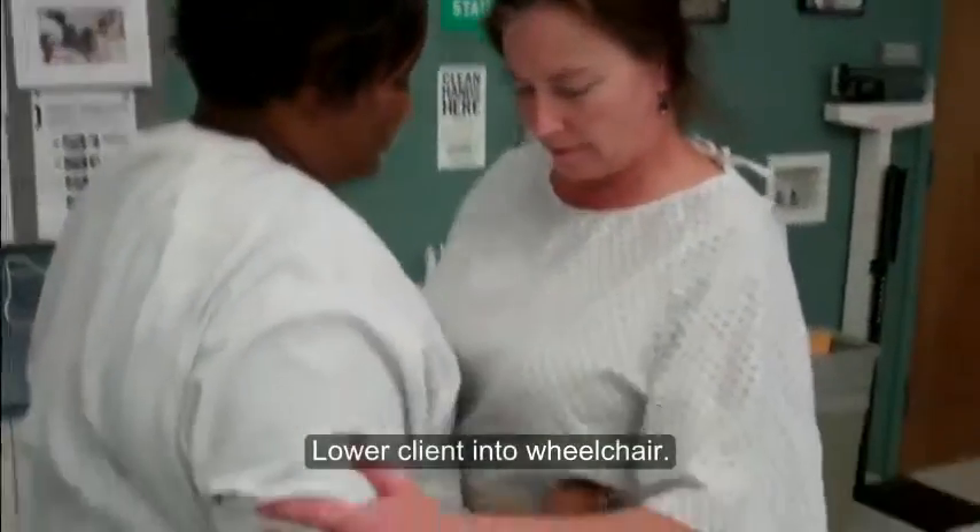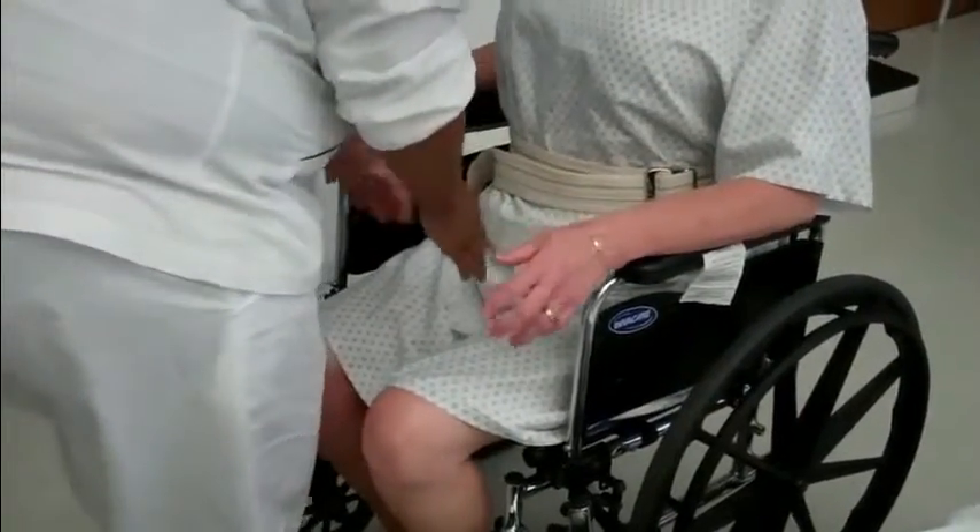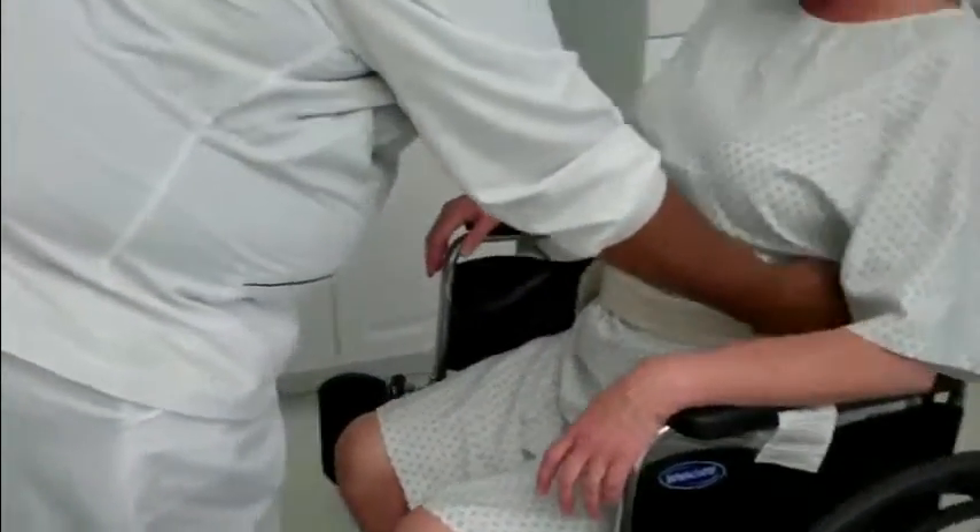I'm going to sit you down now. I'm going to check to see if you're back in your bottom or against the back of the chair.